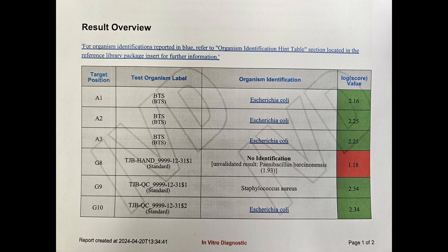But here we also see that the other organisms tested were identified with a higher confidence. The organisms used were stock QC organisms used in the microbiology laboratory, and we can see here they were identified properly.